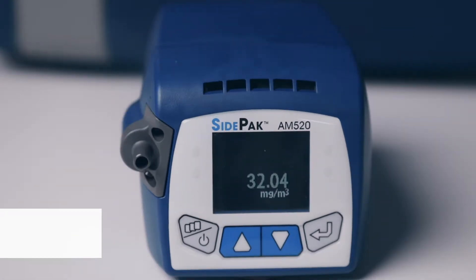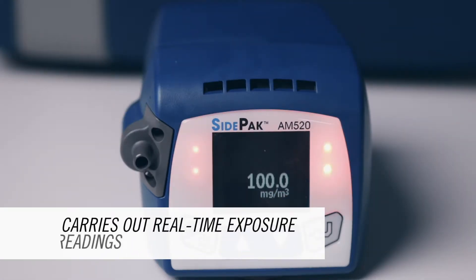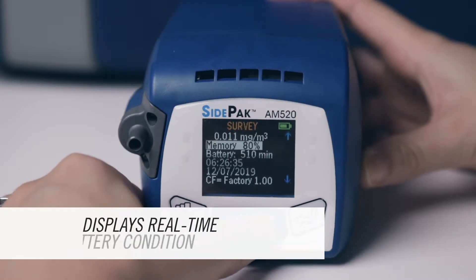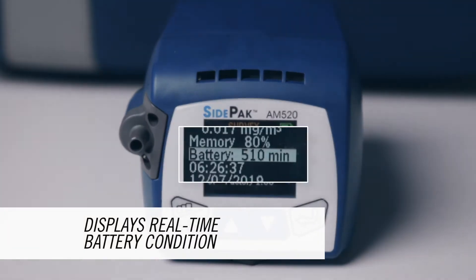One of the biggest benefits of the SidePak AM520 is that it carries out real-time measurement. This also extends to the battery, which will show the real-time battery condition, not just an estimation.